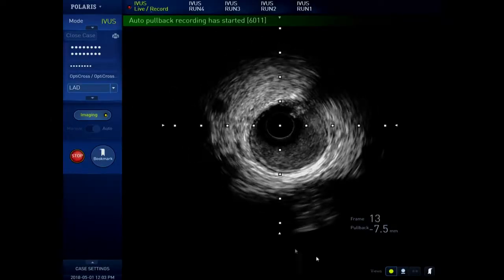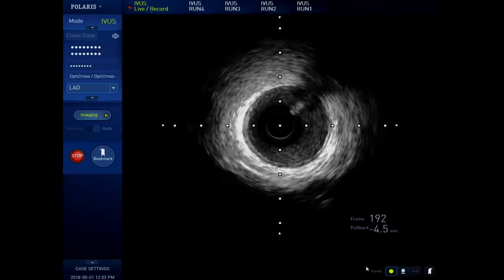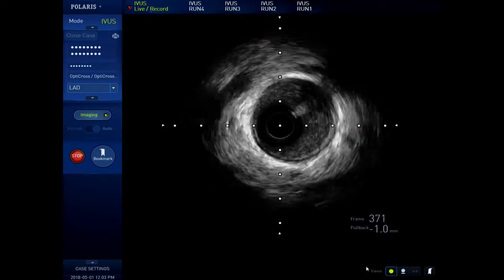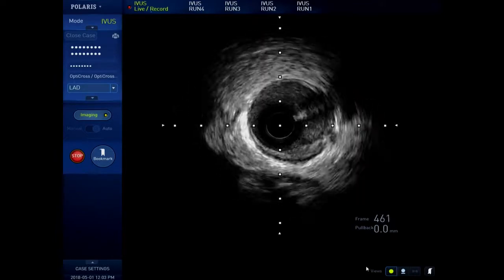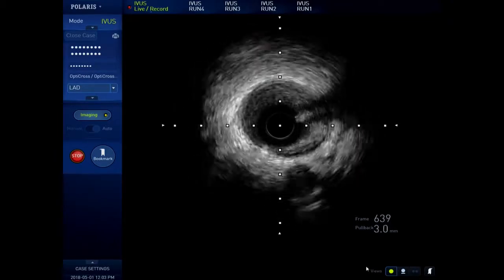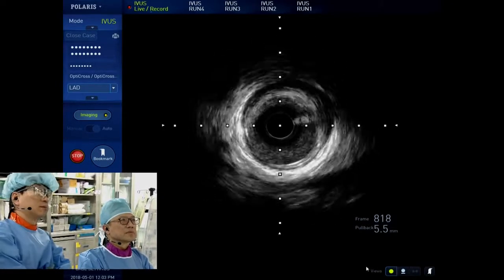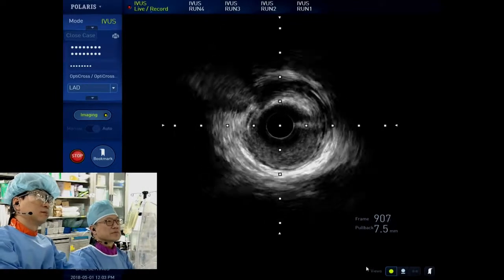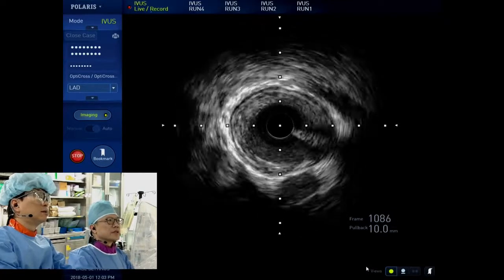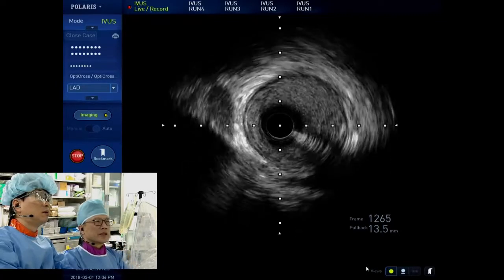Okay? From mid-LAD, normal, completely normal. So that's a good area to put a second stent distally if we need to. Looks nice and clean there. But there's some plaque there now. But the lumen is still pretty good. I cannot see FFR being positive here. They're all about 4. That's the diagonal, maybe? Yeah, diagonal. There's a little bit more ectatic area, a little bit of an atheroma, big lumen.